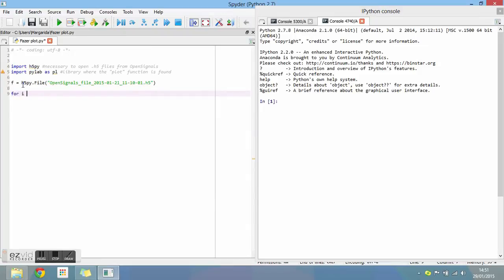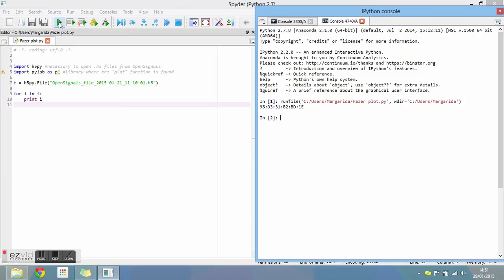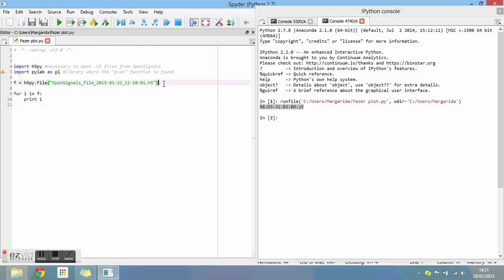Then, we'll use an auxiliary function to find what we want inside the file. Type what you see on your screen and run the program. The MAC address of your file is printed on the console. Write it next to your file name and run the program again.